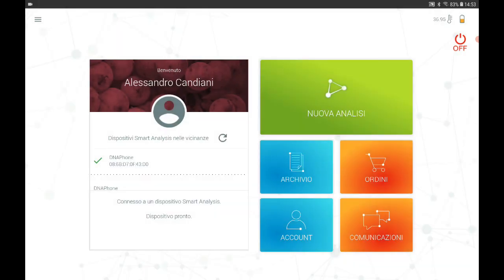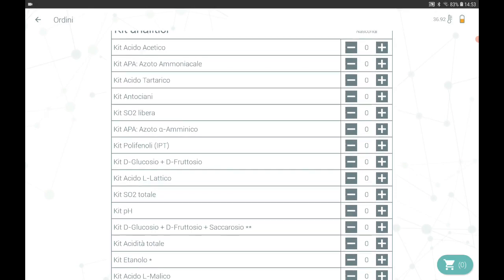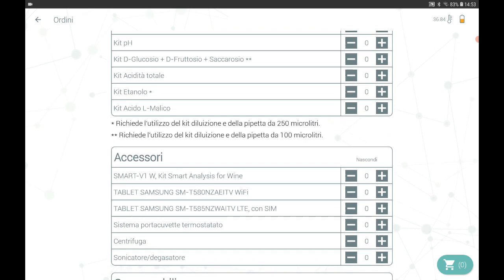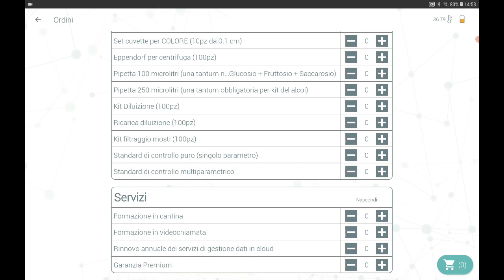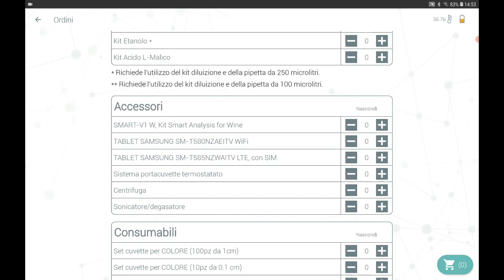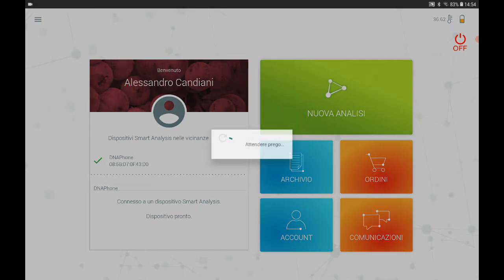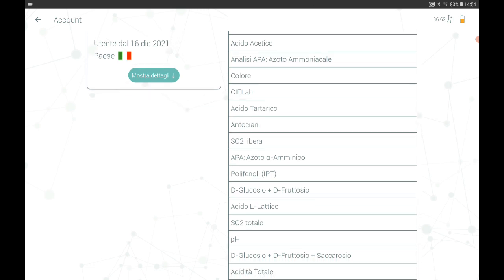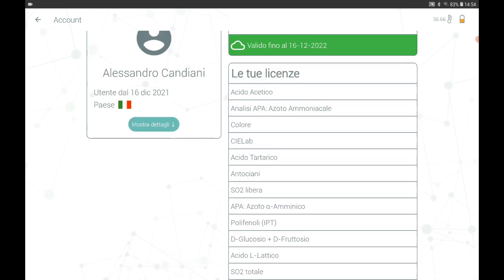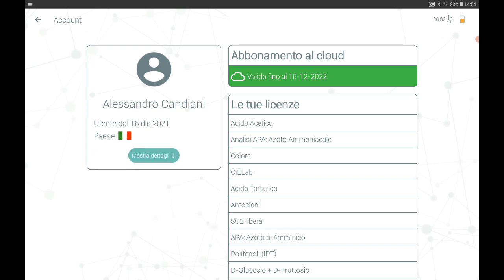Let's look at all the other buttons you'll find on the home page. Starting with the orders button, where you will find the entire list of accessories, reagents and services that you can purchase, and from here you proceed with your order directly from the application. In the account section you will find all the information relating to your account, like all the parameters you have chosen to activate on your application and those that you do not have active. On the left you will see a summary of all analyses you have done so far.